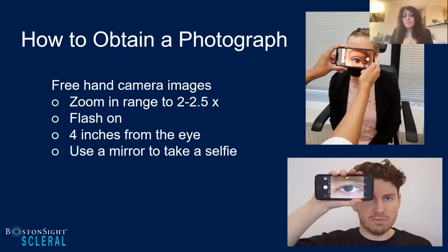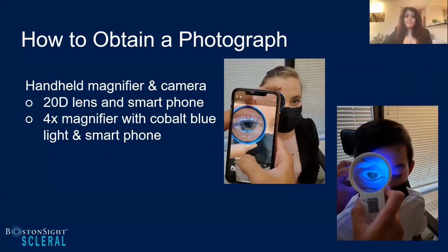This is really good for telemedicine as well. If you want to have your patients and you want to teach them how to take images of their eyes to send you, they can use this exact same technique, except they are looking in a mirror. So we have Dr. Gellies down here who's demonstrating how to take a selfie for his patients when you're doing telemedicine.